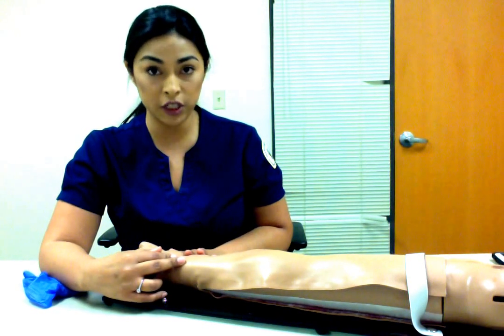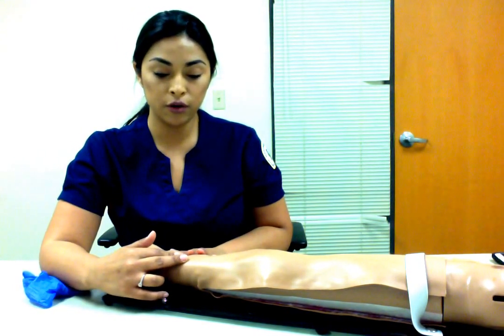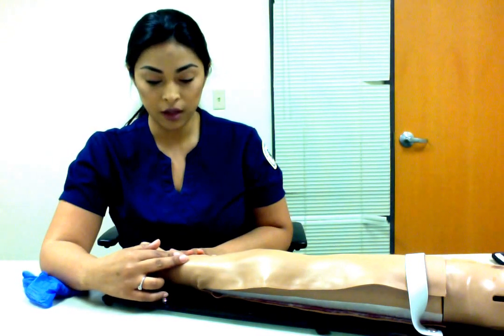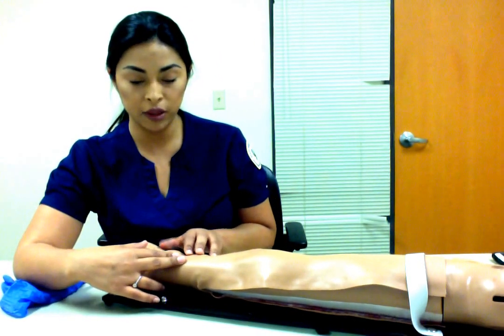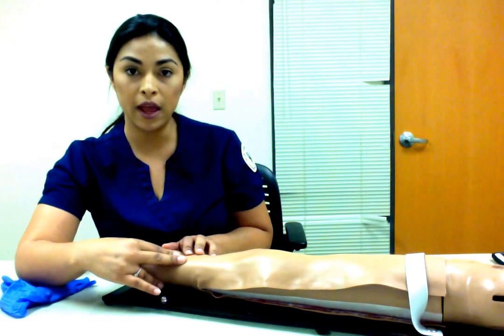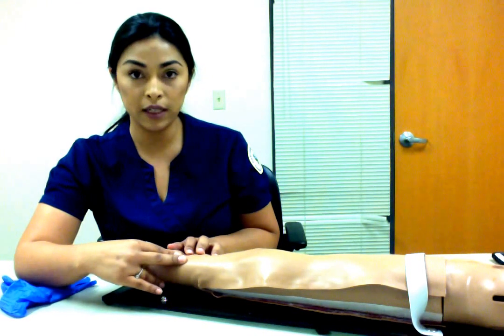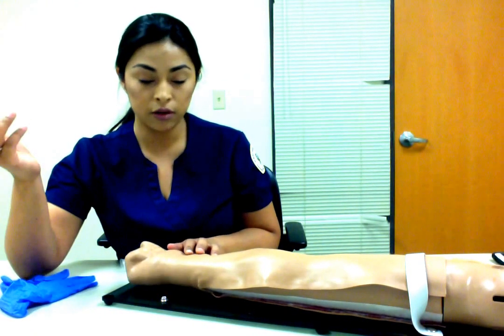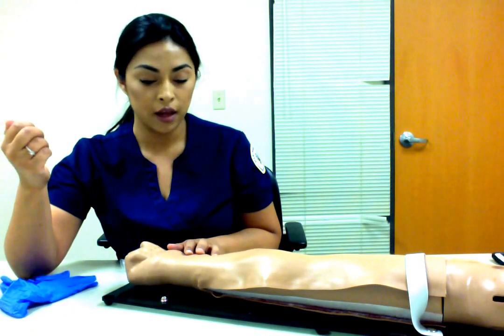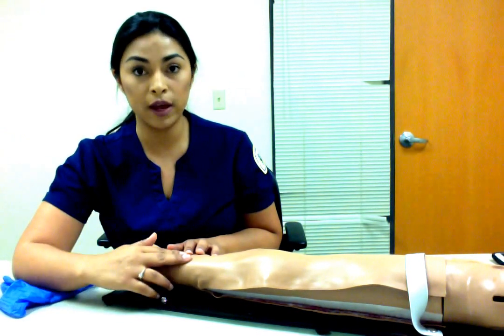If your patient is unconscious or unable to follow directions, then you would again cover the ulnar and the radial pulse, and then with your thumbs, push the blood away from the hand towards the body until the palm turns white. Again, release the ulnar artery, and the blood should be rushing back into the palm, and it should turn red within 5 seconds.